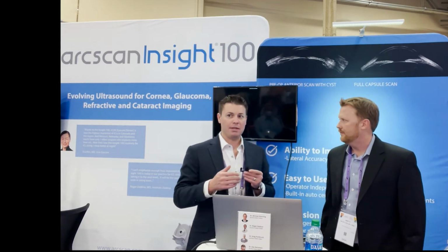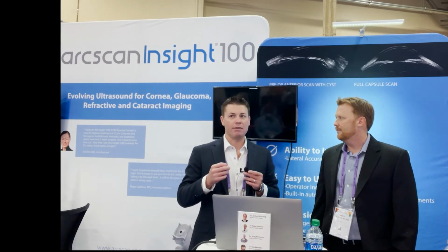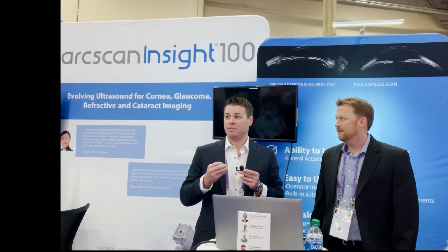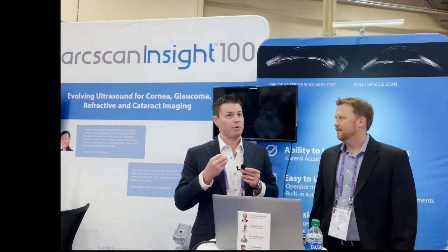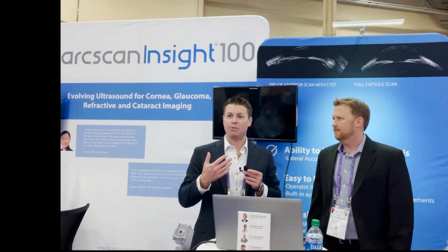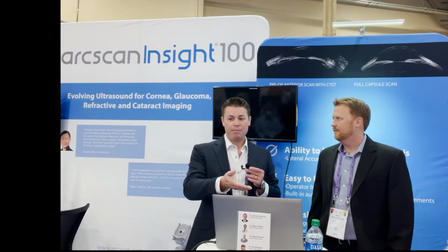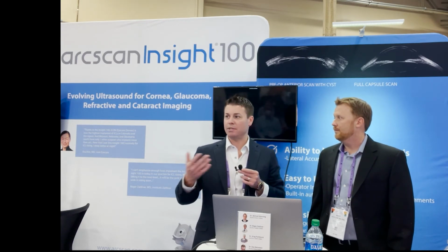And the other thing that I think you pointed out perfectly, when you think about the predictability of being within 300 microns of predicted 97% of the time, that is incredible accuracy. That is where we can start to talk about a topic we've alluded to in the past. What if we can now get to the point with ICLs where we can prescribe a certain vault to a certain patient? Because you're right, in that example you showed, we predicted a 12.6 might give us 400 microns or whatever it was, versus a 13.2 might give us 650.